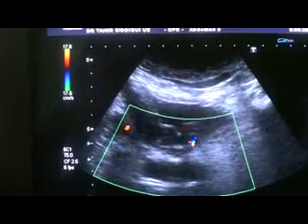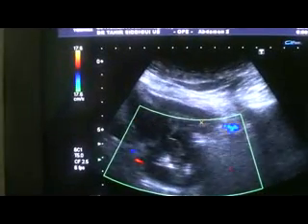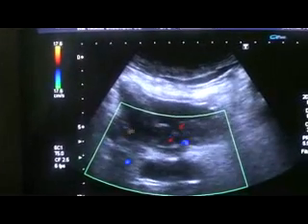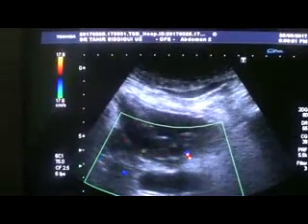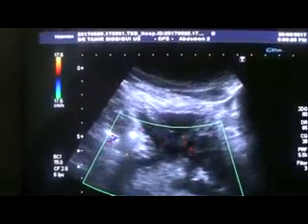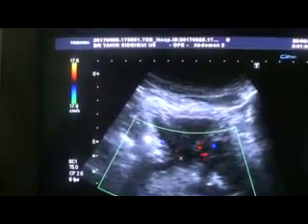And that blocking area, this blockage from this region of the ureterovesical junction, this is the transverse section of the urinary bladder, this is the lumen of the urinary bladder, blocking both ureterovesical junctions, and that is the main cause, that is the reason of the bilateral hydronephrosis and hydroureter that we have seen.